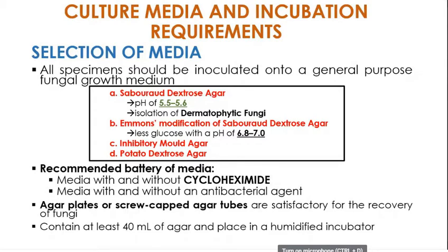Anong macroscopic natin? Of course, you look at the colony. Ano ba ang description ng colony according to its topography and according to its texture. And aside from that, also according to the pigmentation, wherein malalaman nyo later on yung sa pigmentation, kailangan sa reverse kasi pag sa top view mo, pwedeng natatakpan yan ng kanyang aerial mycelium.